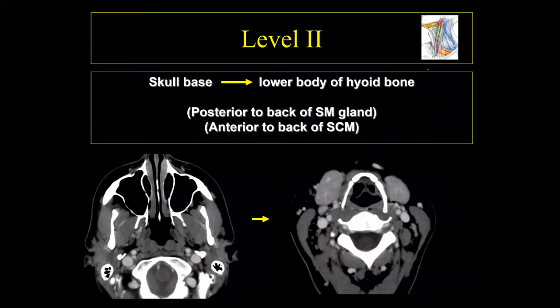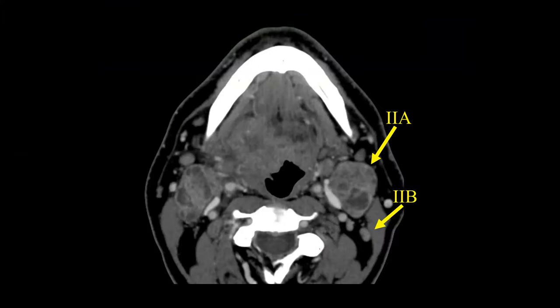Level 2 lymph nodes run from the skull base down to the level of the hyoid bone. Drawing a line connecting the back of the submandibular gland, everything posterior to this line is level 2. Level 2 is divided into 2a and 2b, defined by the presence or absence of a fat plane between the lymph nodes and the internal jugular vein. When the lymph node compresses the internal jugular vein with no fat plane, that's 2a; a large fat plane between the lymph node and the vein indicates 2b.